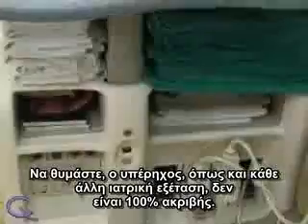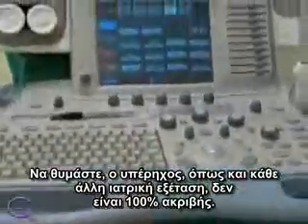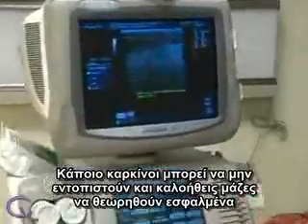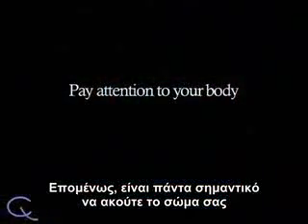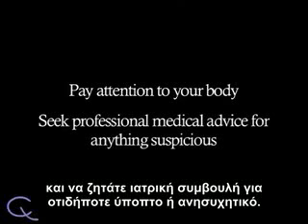Remember, ultrasound, like any other medical test, is not 100% accurate. Cancers may go undetected, and benign masses may be falsely interpreted as possible cancers. Therefore, it is always important to pay attention to your body and seek professional medical advice for anything suspicious or concerning.